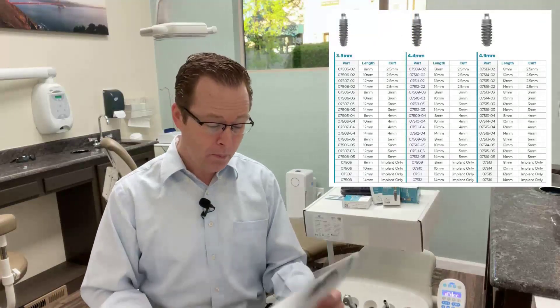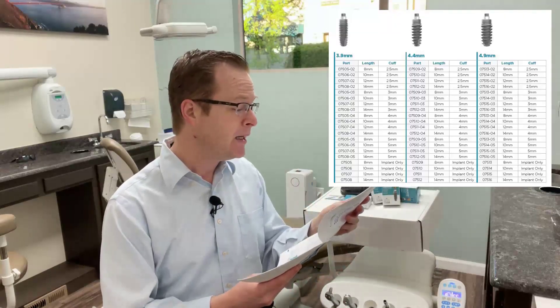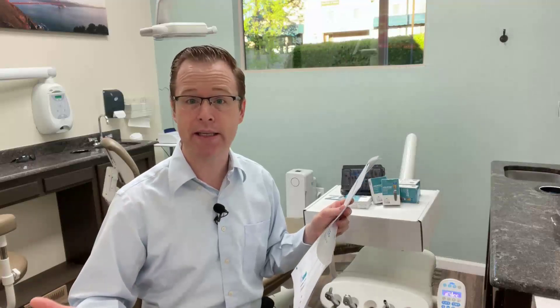When I open it, I have my standard 2.4 and 2.9 in 10, 12, and 14 millimeter lengths. Nothing's changed there — the original Lodi system for the 2.4 and 2.9 millimeter diameter is really identical.